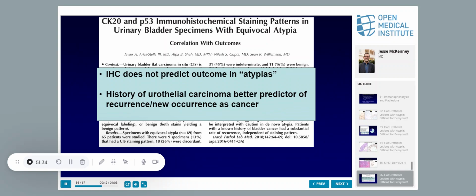That is the best thing that I can say against it. My point is, if you want to use these, that's fine. We do on rare occasion, but you can't let the immuno run your diagnosis by itself. That's going to get you in trouble. That's my main point: don't just close your eyes and go by the immunostains. That's always a bad idea.